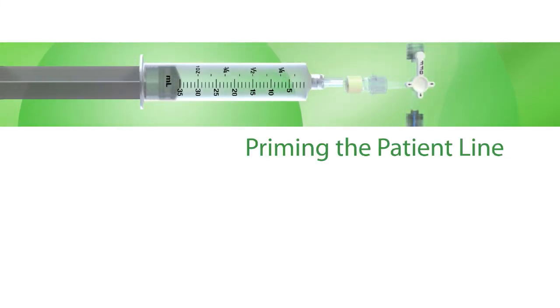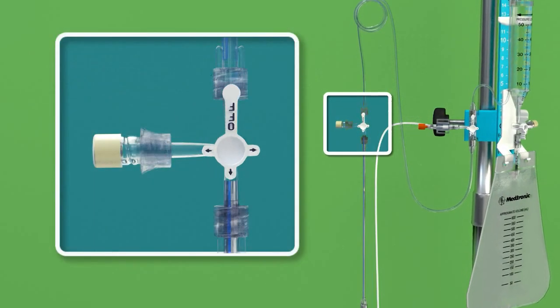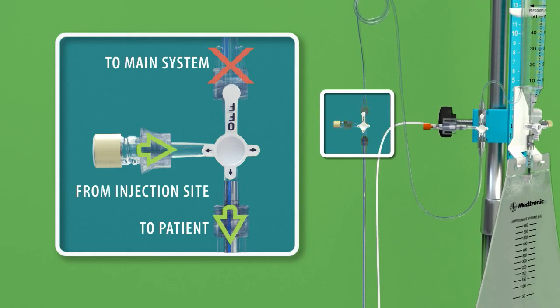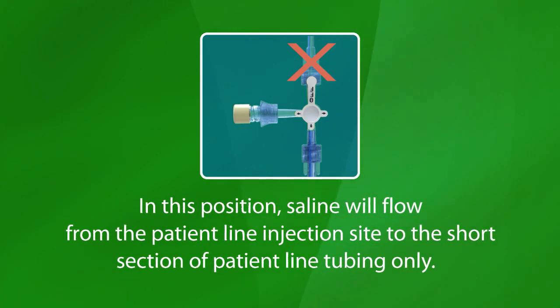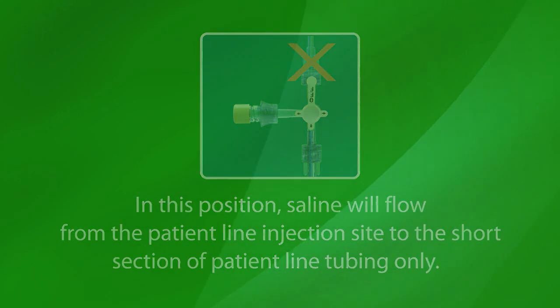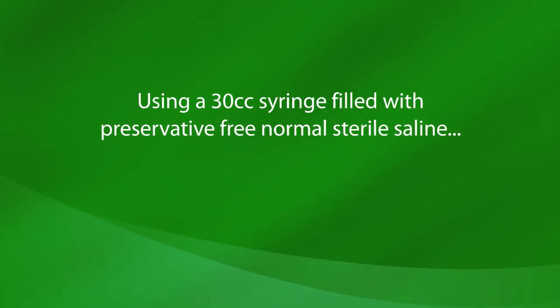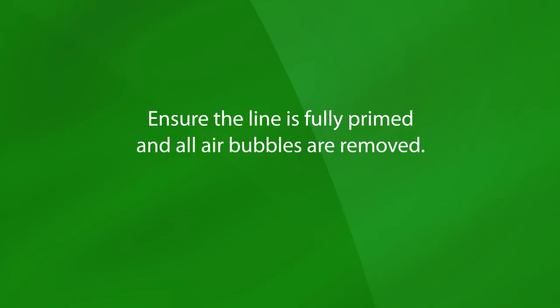Priming the Patient Line. Begin by rotating the patient line stopcock handle, inscribed with the OFF indicator, toward the main system stopcock. In this position, saline will flow from the patient line injection site to the short section of patient line tubing only. Using a 30 cc syringe filled with preservative-free normal sterile saline, access the patient line stopcock injection site and fill the patient line towards the short section of tubing that connects to the ventricular catheter. Ensure the line is fully primed and all air bubbles are removed.